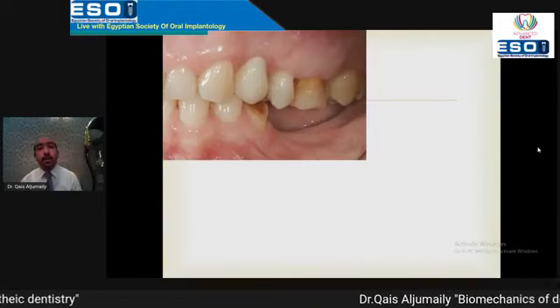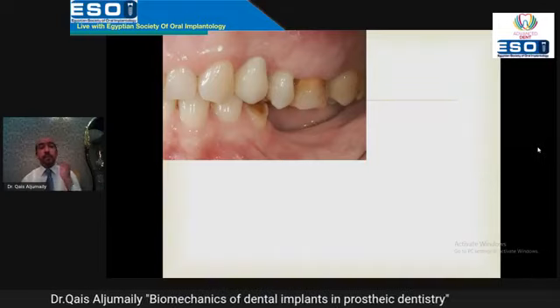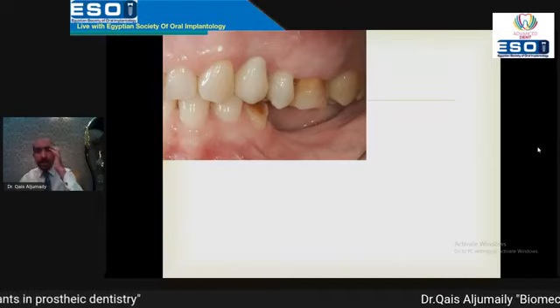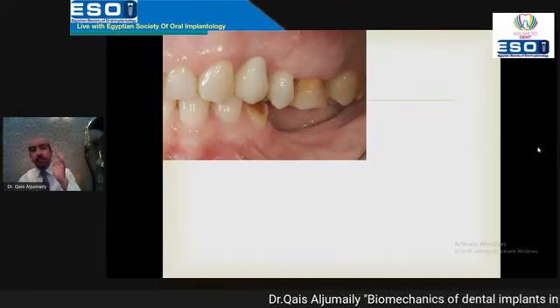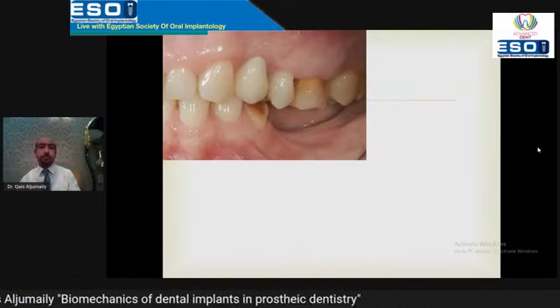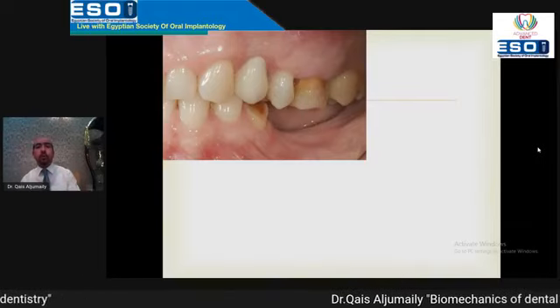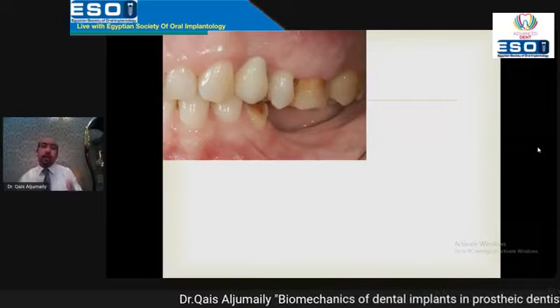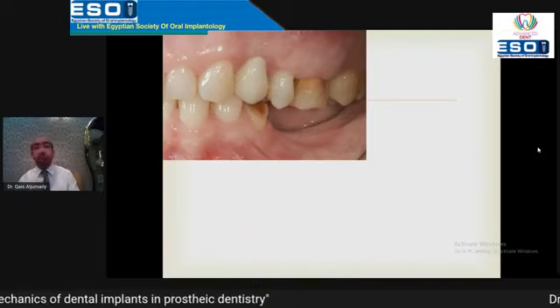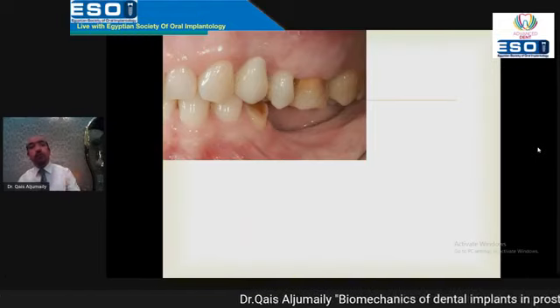This is one of the cases. We can face such a case, for example. Now, if the implantologist has a purely surgical point of view and just focuses on the surgical and periodontal part, immediately he will make a radiograph, a CBCT to check the bone quality and quantity, to think about where to put the implant and how many implants to put. But we must think about the prosthetic part, where we are going to put our bridge.